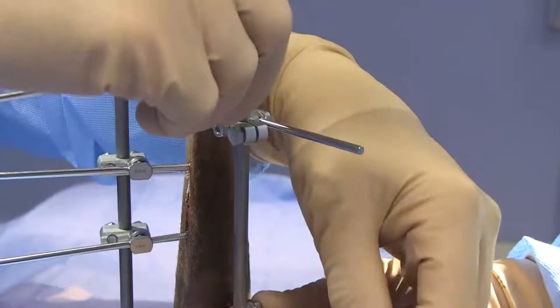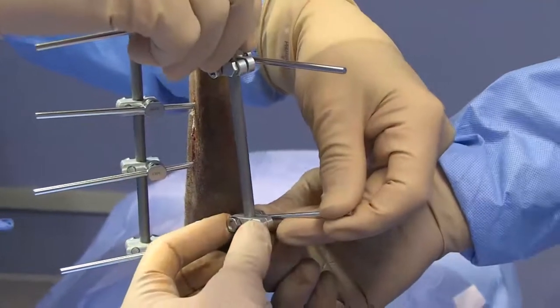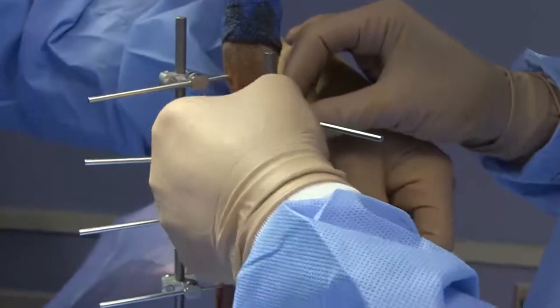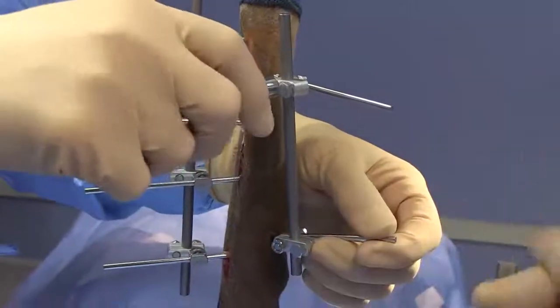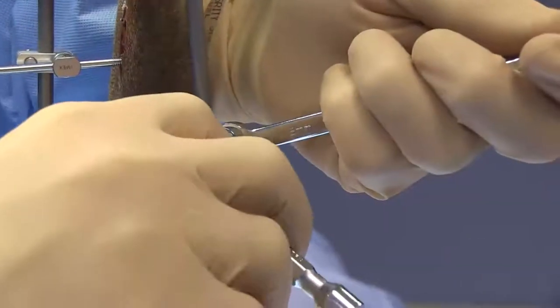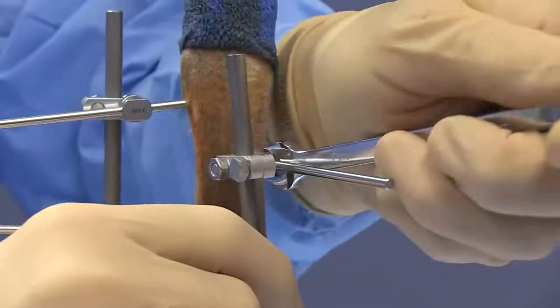We've got both our clamps pre-placed on those pins, loosening the secondary bolt, and we've got our connecting bar engaged into both clamps. Make sure the distance is good and start to snug down those bolts with your fingers, making sure we're not too close to the skin but not too far from it either. We can apply initial tension on those bolts and get them tightened down, then take a step back and assess our type 1b construct — and we're happy with that positioning.